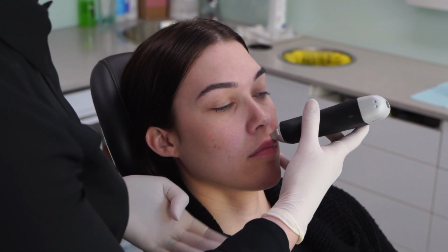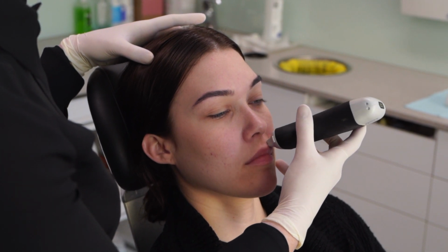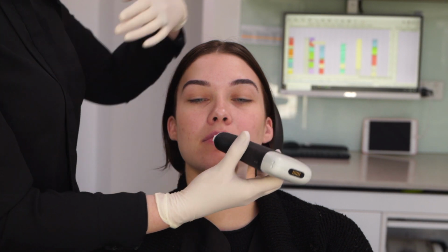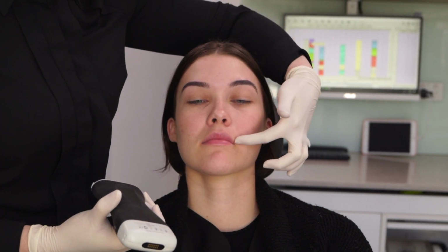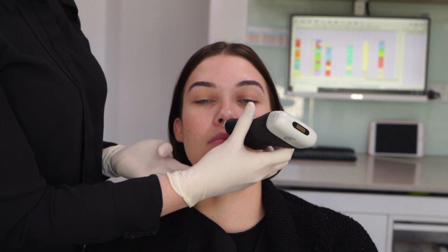Now we will move to the upper lip. We place the transducer on the vermilion part of the upper lip. In this position, you will identify the orbicularis oris muscle and teeth. Here we are looking for the superior labial artery.